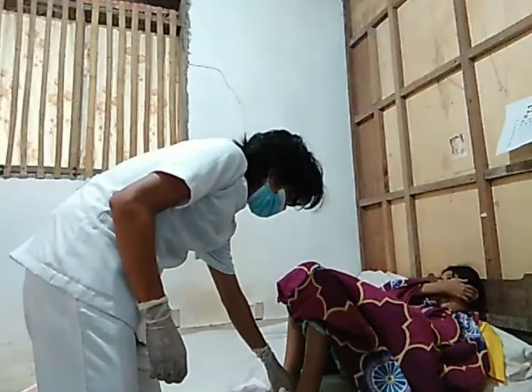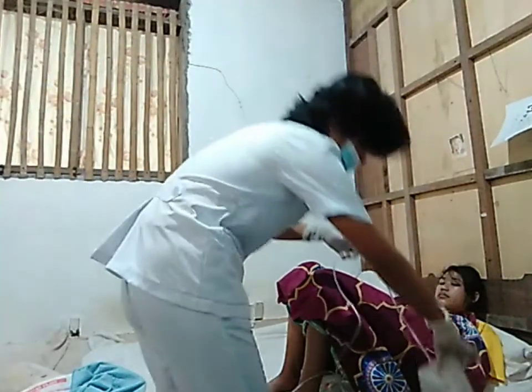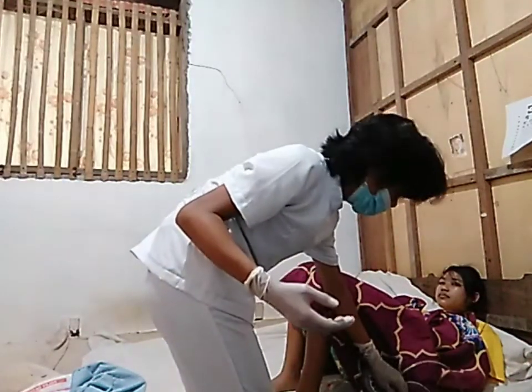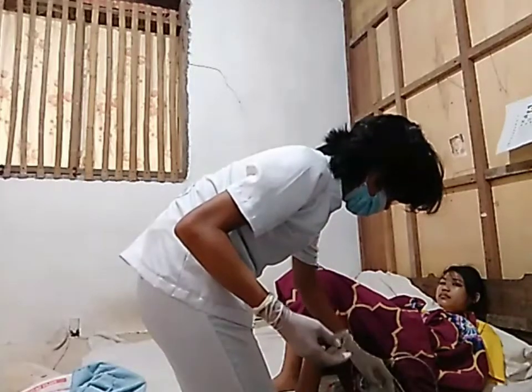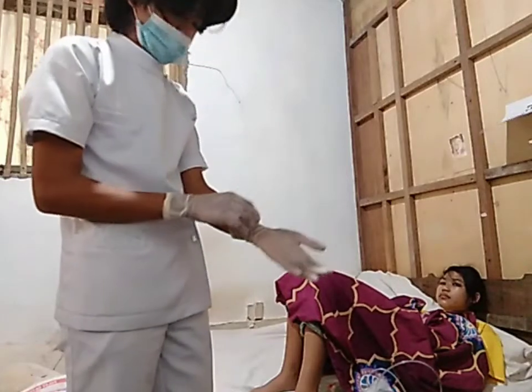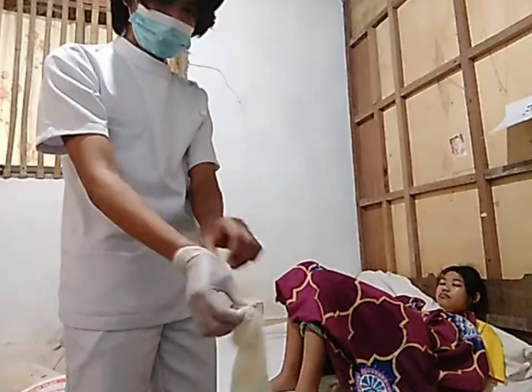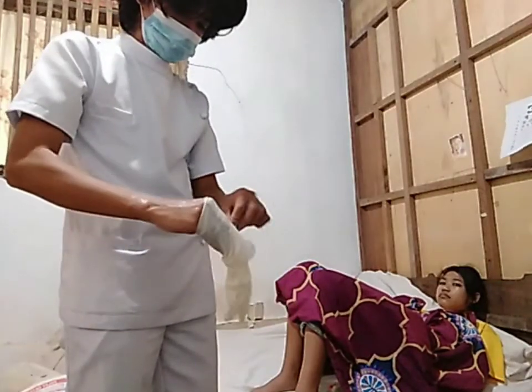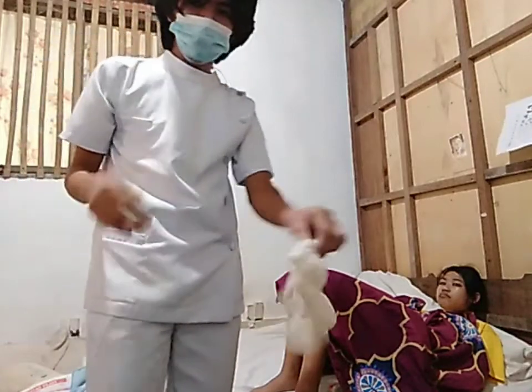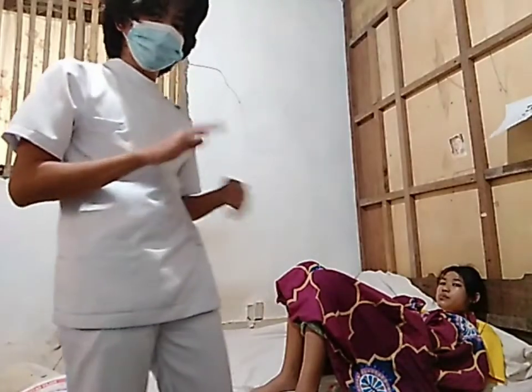Okay. So, and after we dispose, make sure the bag is on the left side of the bed of the patient, na hindi magagalaw ang bag. So, for that, assuming that we already put the gloves on the bedside of the patient, and next is remove the gloves. Okay. And dispose the gloves and perform hand hygiene. So after we perform hand hygiene, document everything.